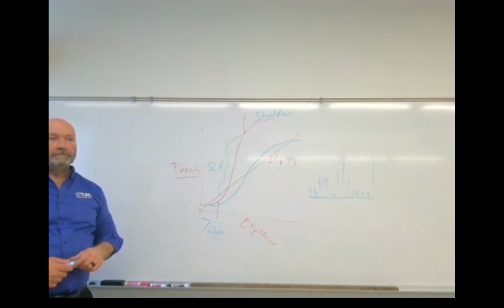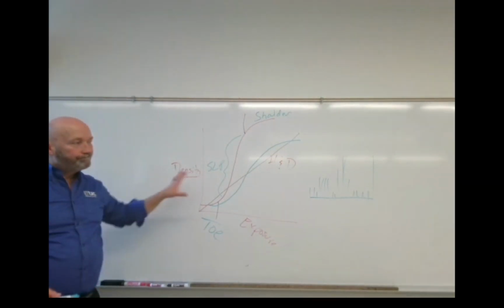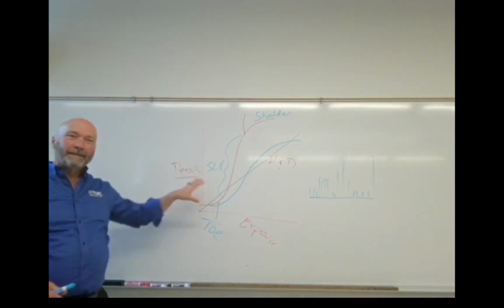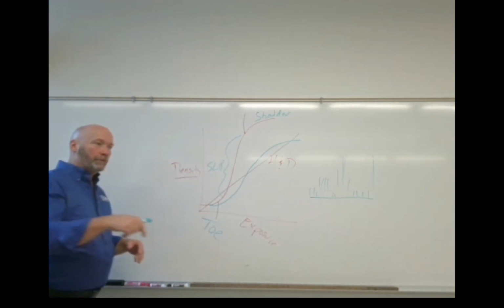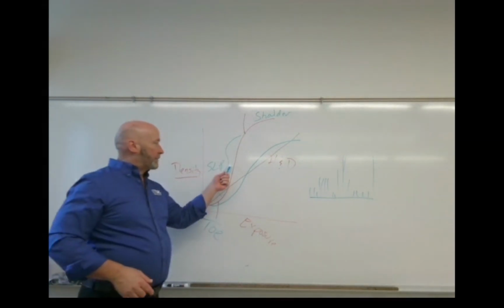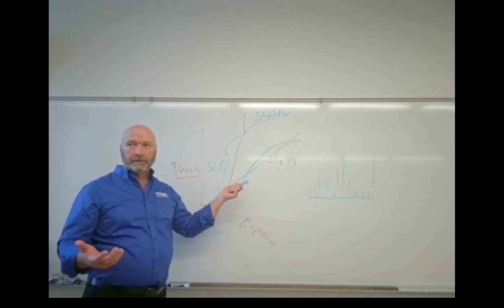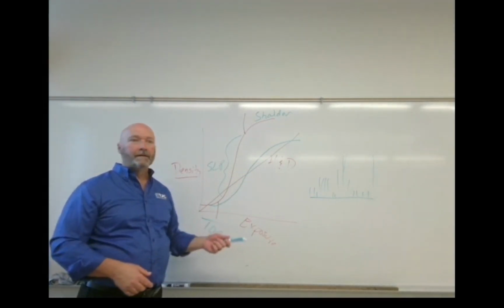H&D curve in 4 minutes. Okay? So again, you may see this on a test, and you may be asked the specifics of two H&D curves, but what they really indicate is what kind of computer algorithm you are applying to the exam type. So you push chest x-ray and you want to see ribs. This is what you should have applying to your exposure. This is what you are applying to your exposure. Not optimum. Can you see the ribs on chest x-ray? You can, just not real good, right?